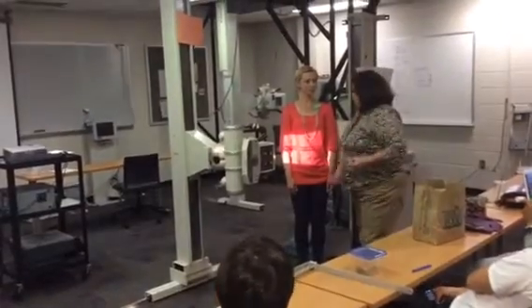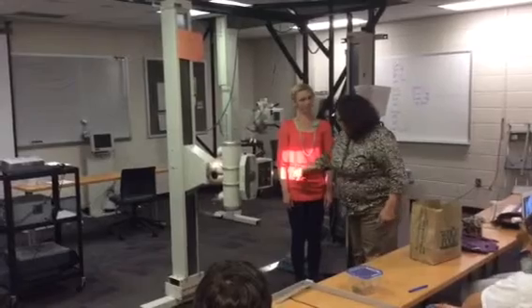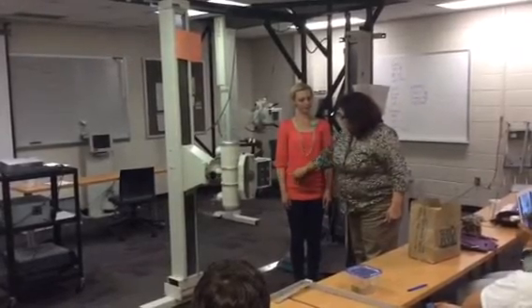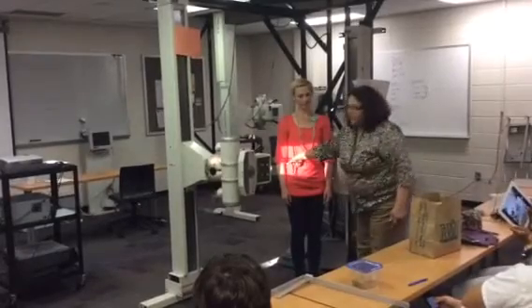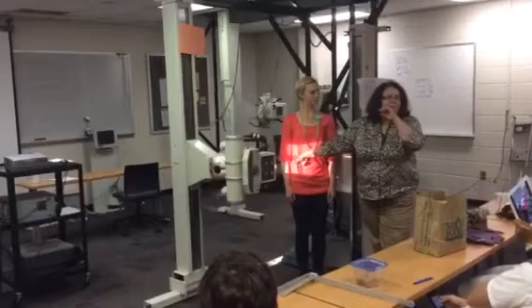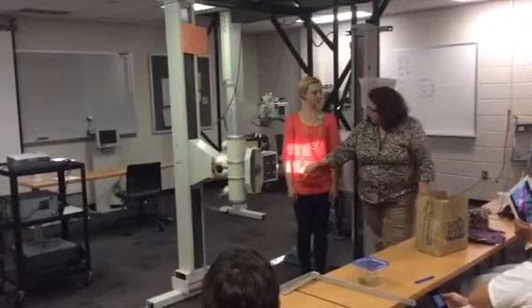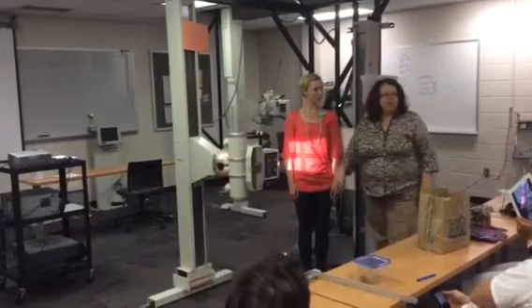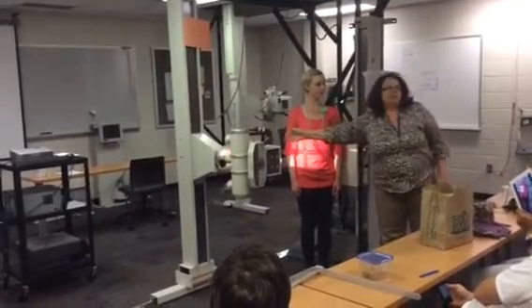Okay? Now, the collimation, the vertical part of the beam, you should find the ASIS and then enter about 1.5 inches medial to the ASIS. And she's already positioned that way. I'm not going to move her because she's already in that position. So the vertical line is 1.5 inches medial to the ASIS. That's on the side that's closest to the tube.